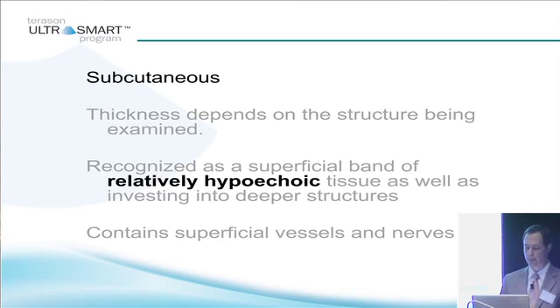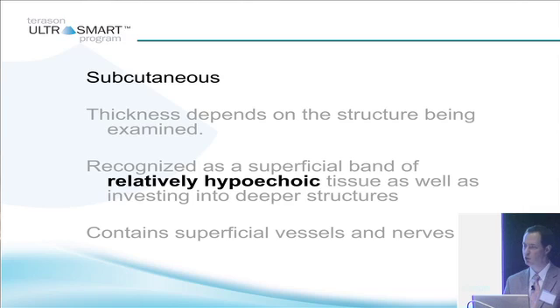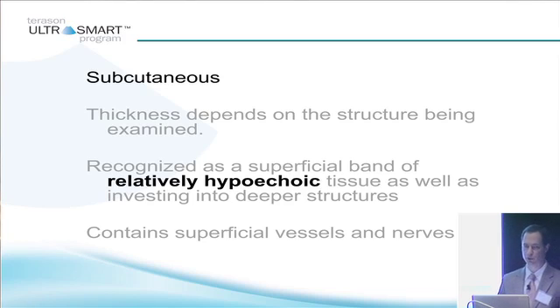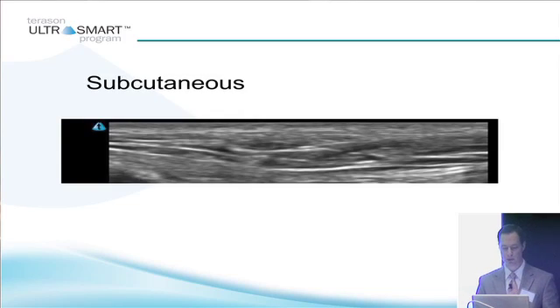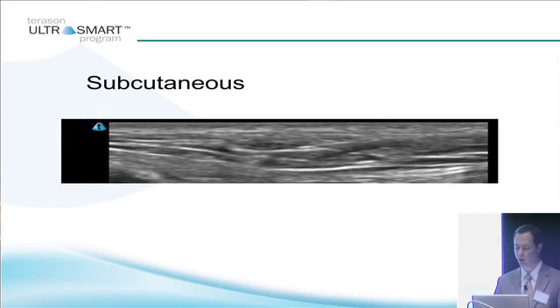Let's talk tissues. Subcutaneous tissue — the thickness depends on the structure being examined, and it usually looks relatively hypoechoic as it invests into deeper structures. It can contain vessels and nerves which are superficial and can also invest into deeper structures. Here's some subcutaneous tissue. It can appear sort of alveolar, hypoechoic, with small, thin, hyperechoic bands in there, and it's at the very top of your screen.